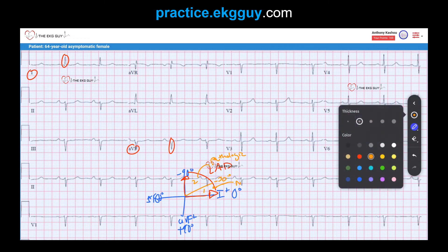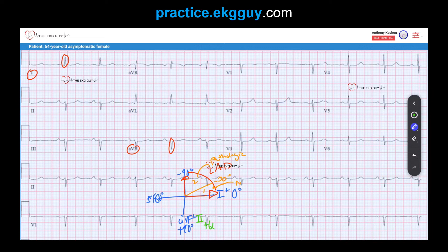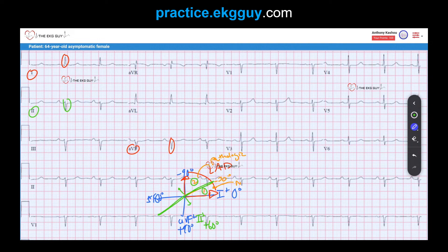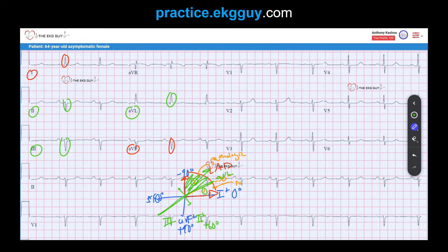To determine whether we're beyond negative 30 degrees, we look at lead II. Lead II sits at positive 60 degrees, and its perpendicular intersects right at negative 30 degrees. If lead II is positive, the axis heads toward lead II and falls in the normal variant area. If lead II is negative, the axis falls in the pathologic region. Looking at lead II here, it is negative — confirming a true pathologic left axis deviation. This is further supported by AVL being positive and lead III being negative.